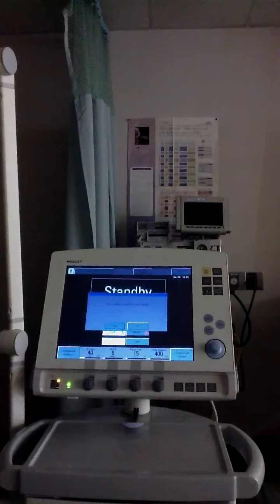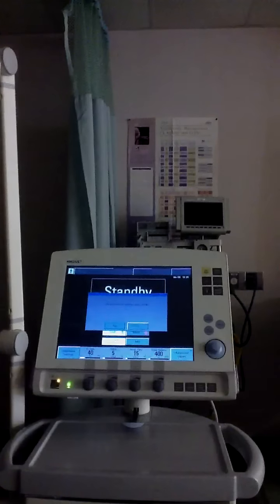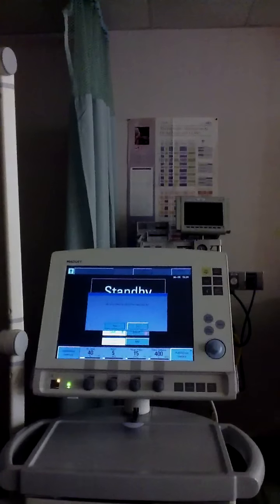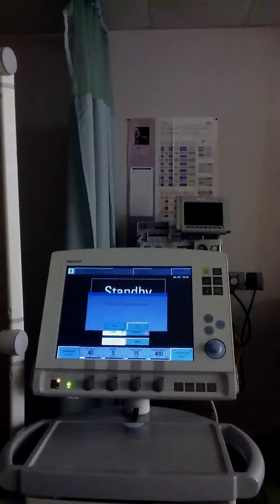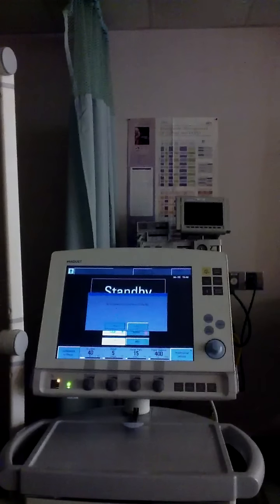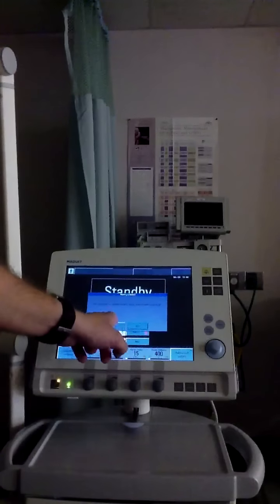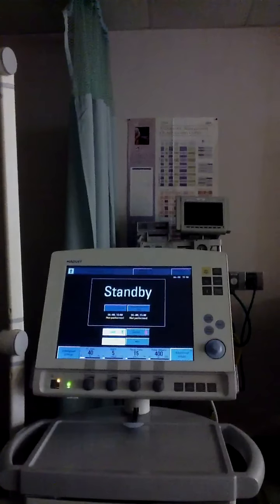Step two: get my equipment ready. I can't show you the whole ventilator here — I'm just focusing on the screen right now, but I do have the ventilator set up. I have an HME on the tubing and it's hooked to oxygen. The screen asks if I want to start pre-use checks. I'm going to hit no here, but this is the point where I would actually do the SST. The SST takes several minutes to do. We'll just do a gedanken exercise and pretend we did it. On the Maquet Servo-I, I'd simply hit yes and it would walk me through a series of steps. Step two is done.